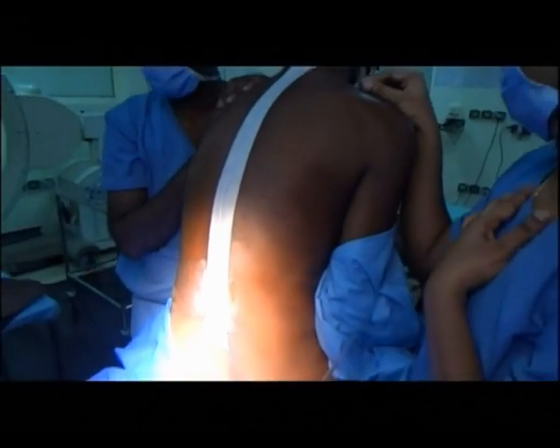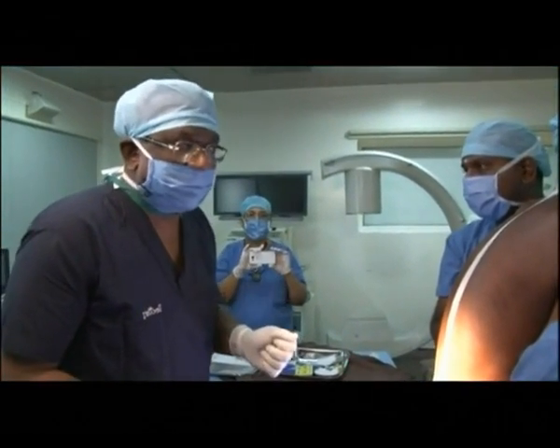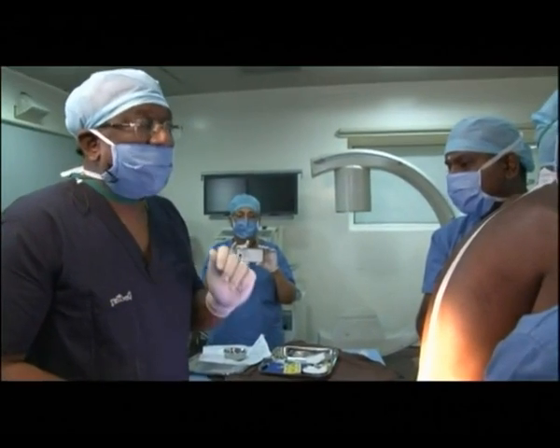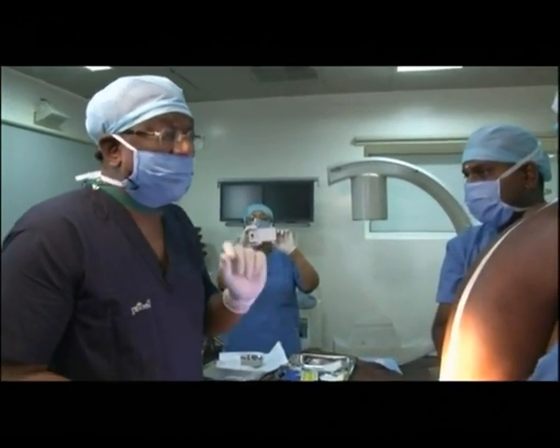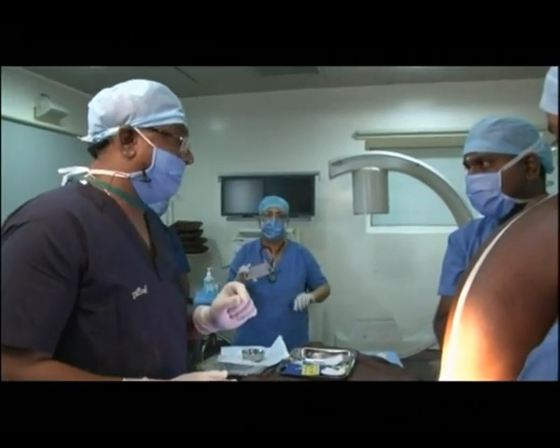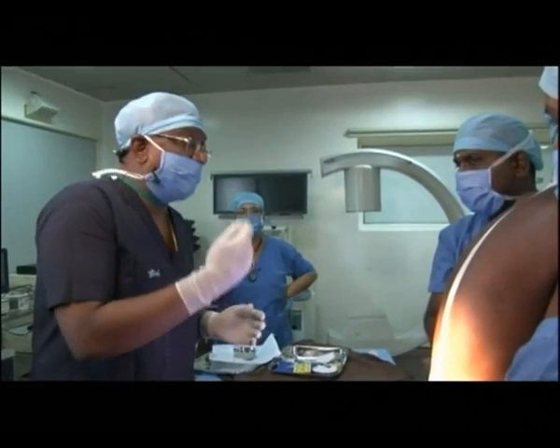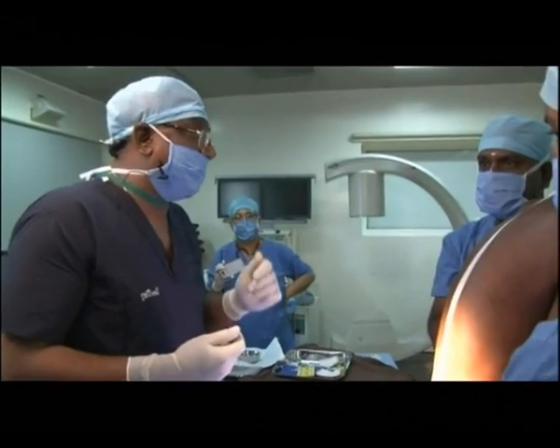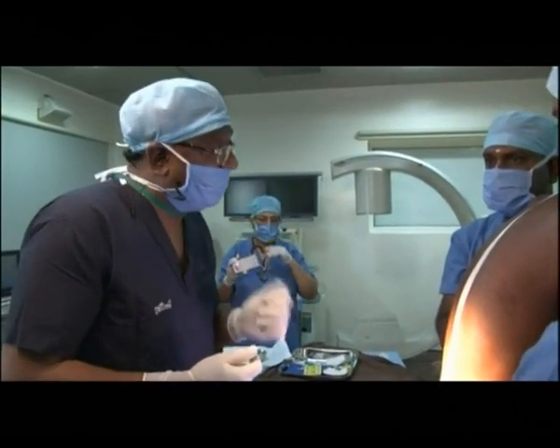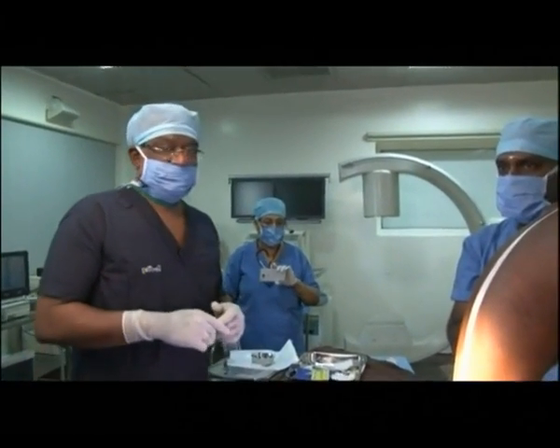I prefer a Vygon needle because they have these polyurethane catheters which are very, very soft when compared to these catheters. Thereby, the chances of inadvertent arterial puncture or venous puncture are very much reduced. These catheters are much stiffer. So actually sometimes there is a plexus of veins or something like that. So when you try to maneuver it, it pokes the vein and it starts bleeding into the catheter. Whereas this is not seen in Vygon catheters which are made of polyurethane. So I generally prefer to use polyurethane catheters.